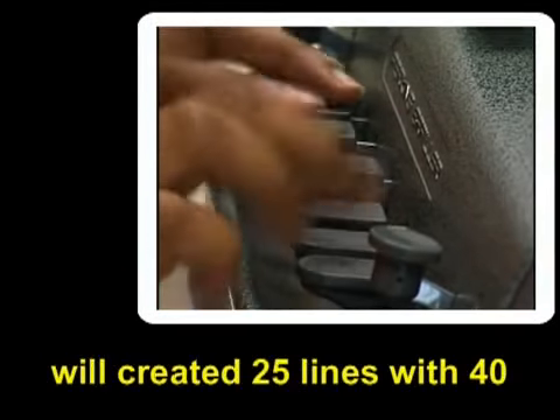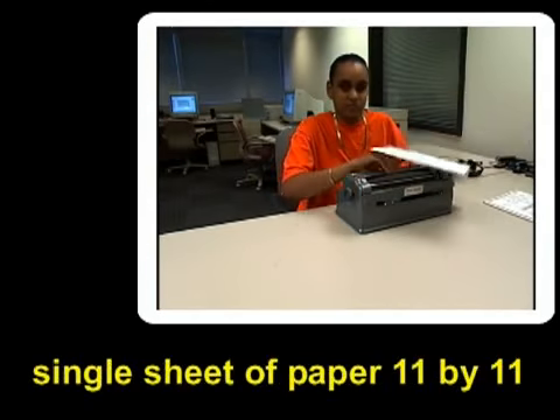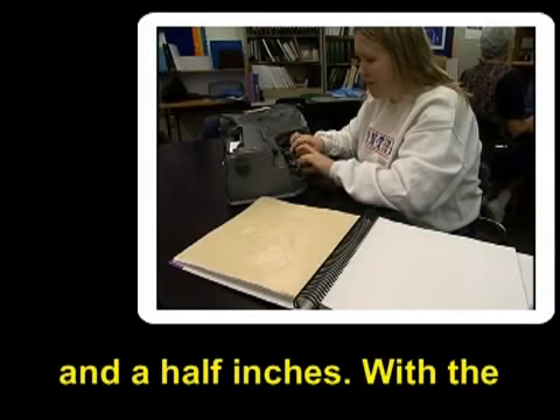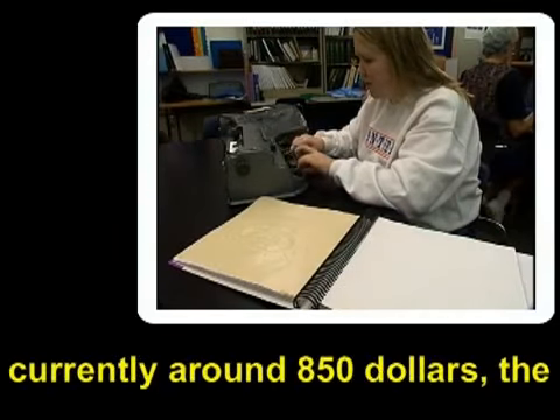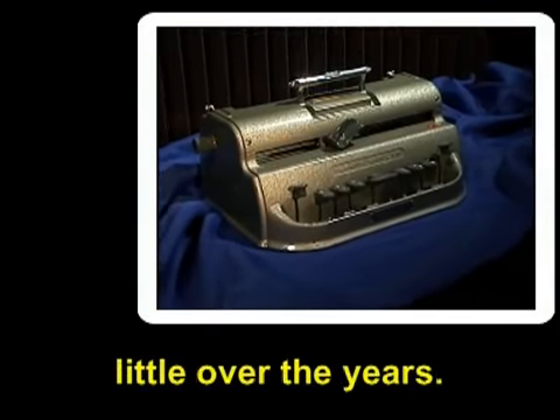The device will create 25 lines with 40 characters on each line on a single sheet of paper, 11 by 11½ inches. With the exception of its price, which is currently around $850, the Perkins Brailler has changed little over the years.